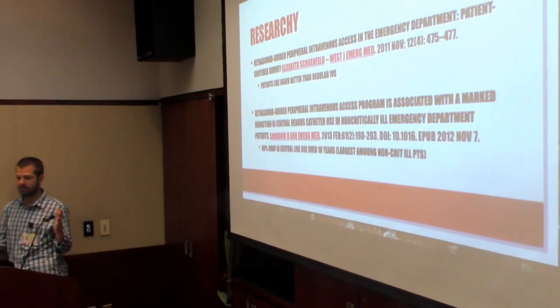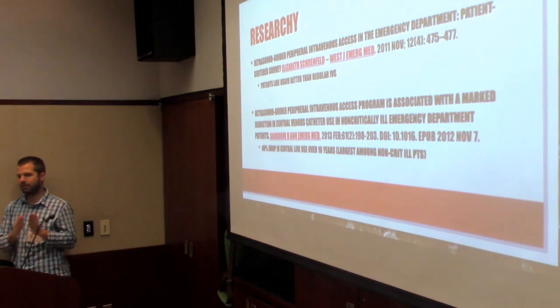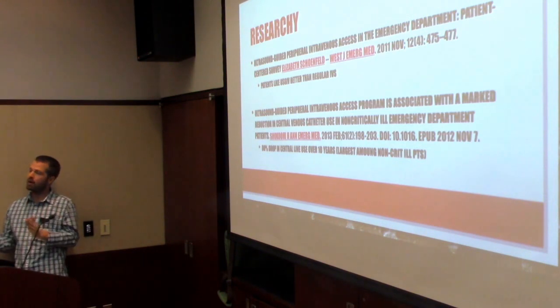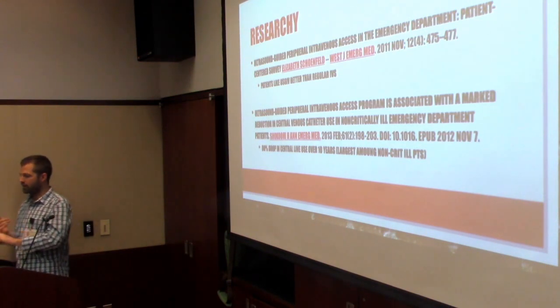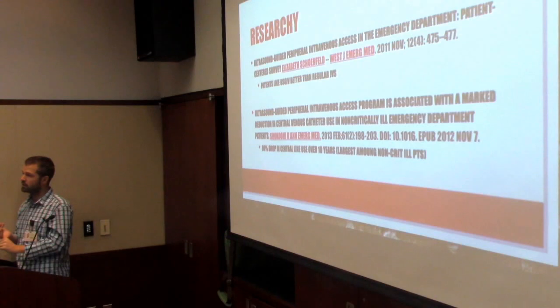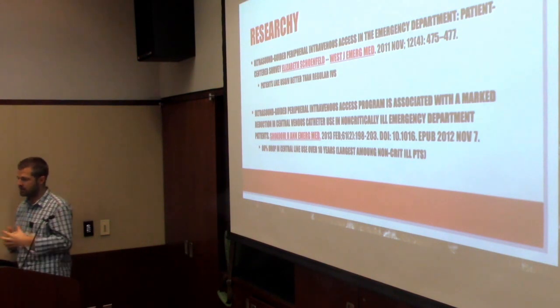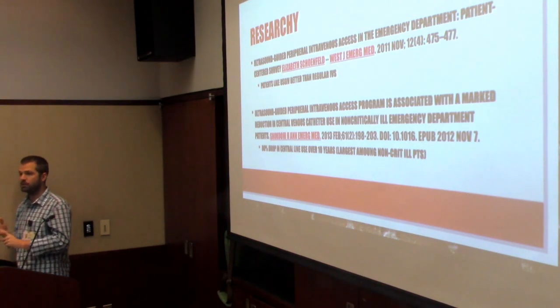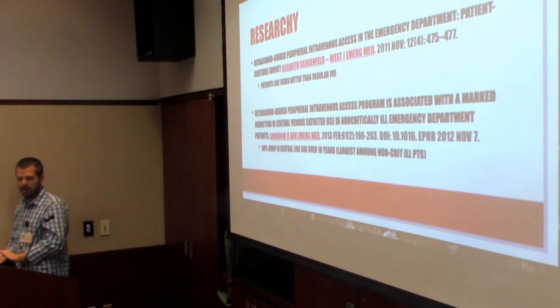So they surveyed all these patients and asked them about ultrasound-guided IVs, and I think it was on a Likert scale of 1 to 5, the average for a regular IV was like 2.5, and it was 4.5 for ultrasound-guided IV. They felt like you were giving them superior care because you were using technology. Instead of blindly stabbing around, you were thinking about where you were going, considering different options, and you get it in on the first or second attempt, and you avoid muscles, nerves, and other things that are going to hurt them. So patients loved it.